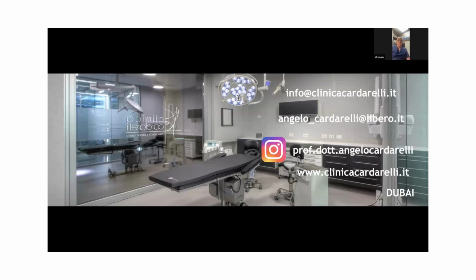Yeah, I agree with you. Also, the intermaxillary distance was big. And the crown to implant ratio was unfavorable. Yes. Which is something to consider when you have such an atrophic maxilla and a huge intermaxillary distance. That could compromise it, definitely. Yes. Okay, that's confirmed what I thought, and bellissimo.